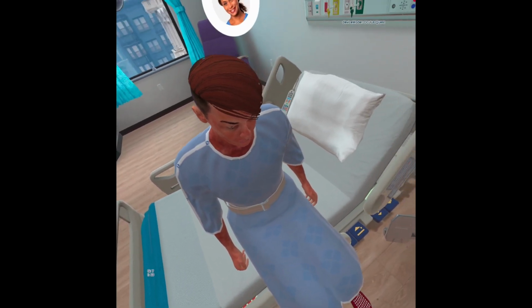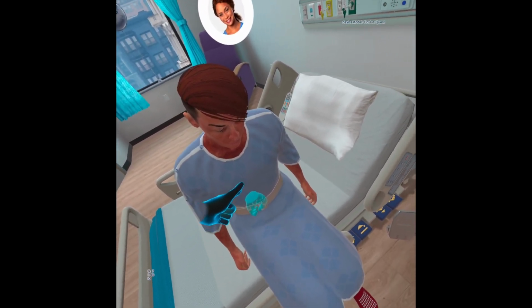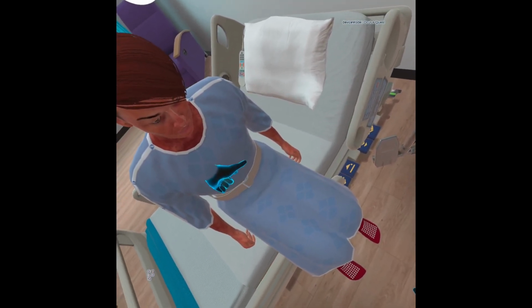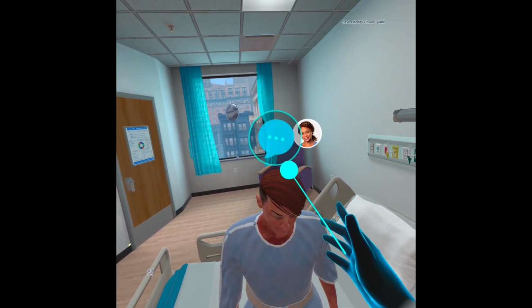We need to check that only 2 fingers fit between Riley and the belt to make sure it fits correctly. Place your extended fingers between Riley and the belt. Good. The belt fits correctly. I'll tuck the loose end into the back of the belt so it stays out of the way. There. Tell Riley how we'll help move him.